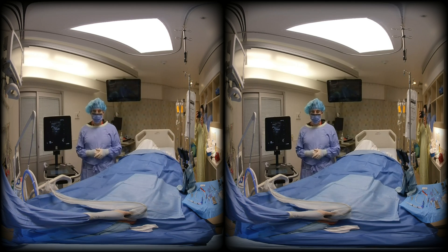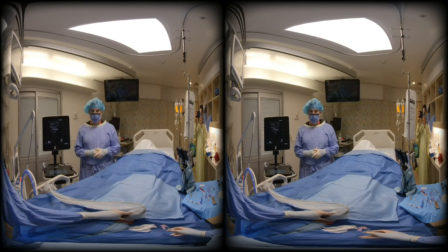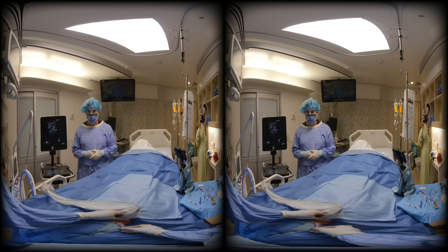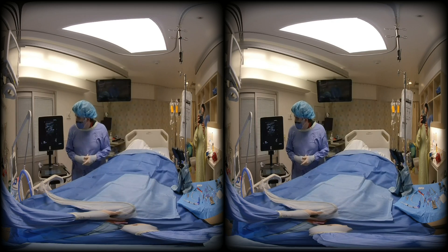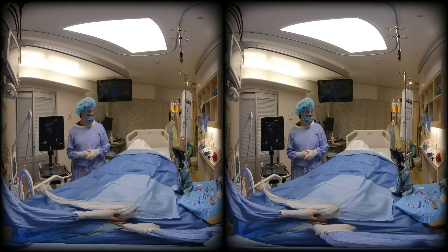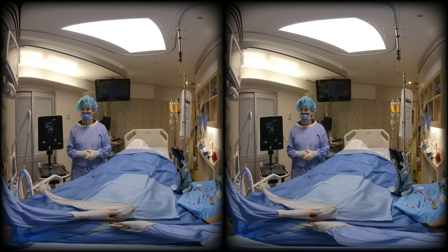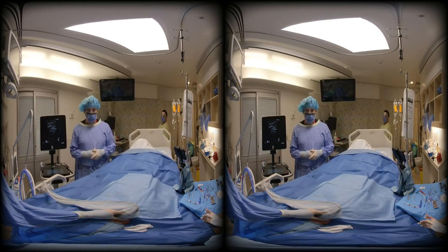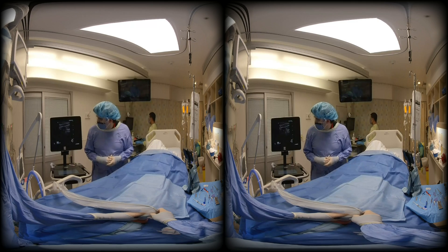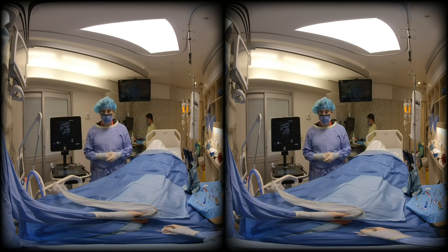Next, you will use your ultrasound to help guide local anesthetic injection and infiltration to anesthetize the skin. You may want to anesthetize a broad area, acknowledging there may be a small incision with dilation and subsequent suturing of the cannula to the skin once the procedure is complete. You may notice some small distortion of the skin as local anesthetic is injected.